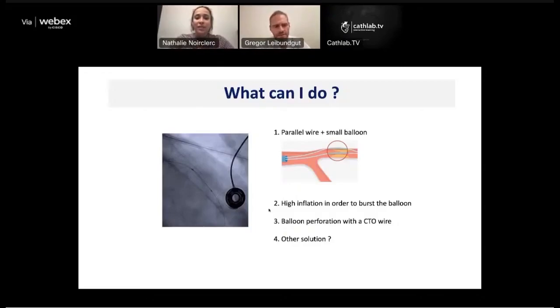Sorry, I didn't quite understand. You placed the second stent. Yes, below. The stent was underexpanded, or is this the stent balloon? Yes. So I placed the stent, it was underexpanded. I deflated the balloon of the stent, and the balloon got trapped. But did it deflate completely? Yeah, it deflated completely, but as the stent was underexpanded, I couldn't retrieve it because it was pinched.